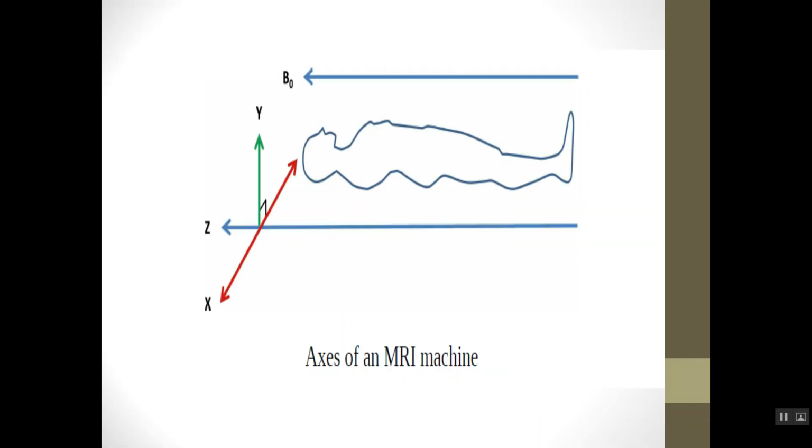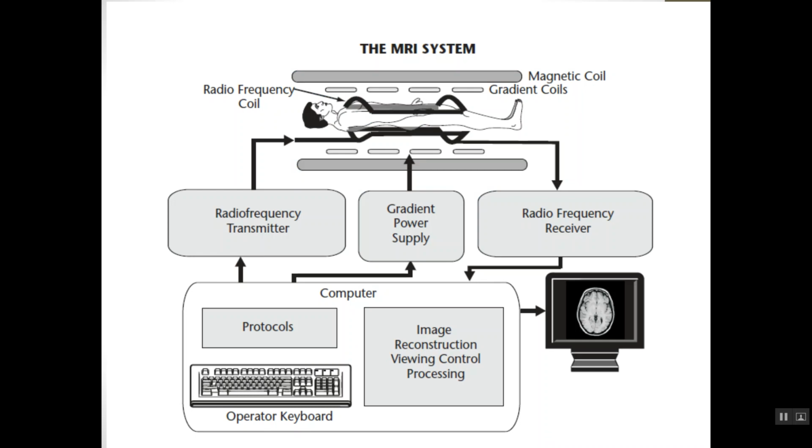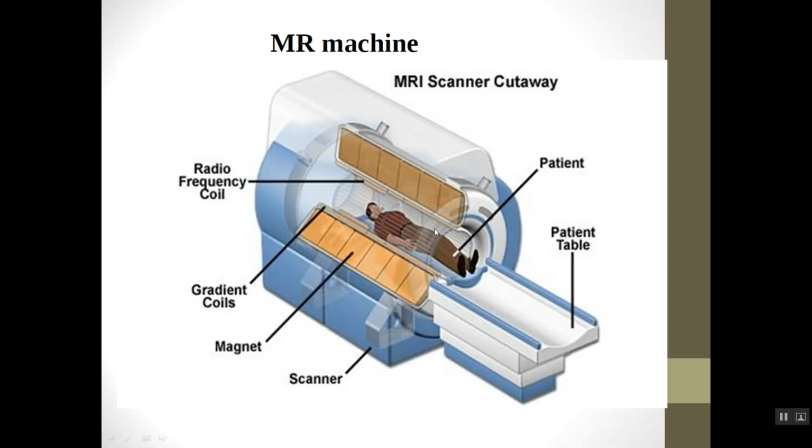So I want you to understand something. Here there is a magnet, a closed MRI. You will find the patient here inside the magnet.